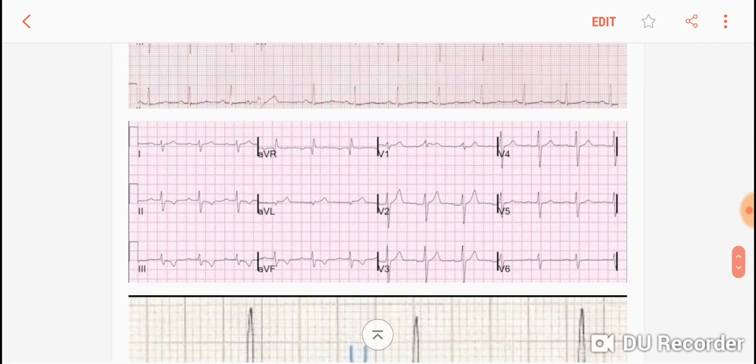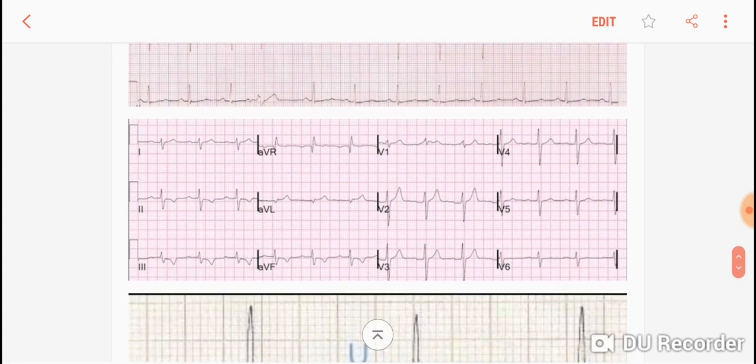In this diagram figure you have 2, 3, AVF T wave inversions, so this is an inferior wall NSTEMI if the cardiac markers are present.